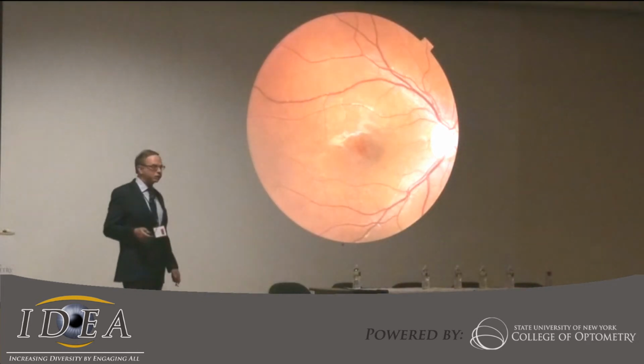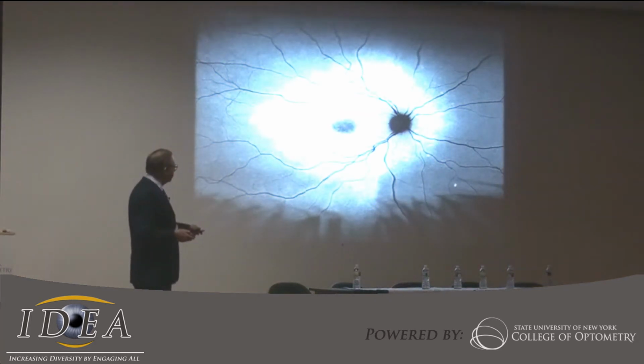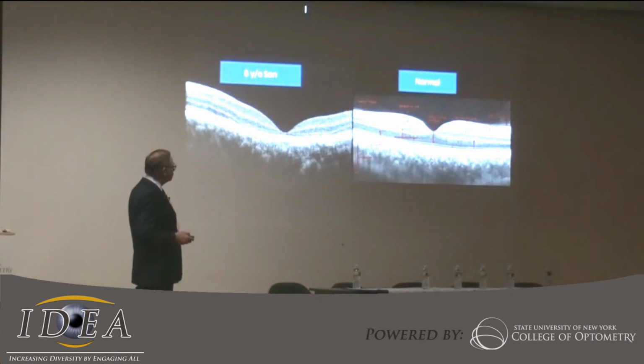Here's a patient I saw within the last 2 weeks. We've heard about my brother, interestingly enough, a 7.5-year-old with reduced vision, about 20/100 or so. Fundus really looks pretty good. Here's autofluorescence, what do you think? That's normal here. That's hypoautofluorescence, death of the retinal pigment epithelium and associated photoreceptors, and all this is hyper. And these little spots, which aren't quite round but fishtail, tell us that this patient has Stargardt's disease with fundus flavimaculatus. Bilateral symmetric, yes. Here's what a normal OCT looks like on the right.